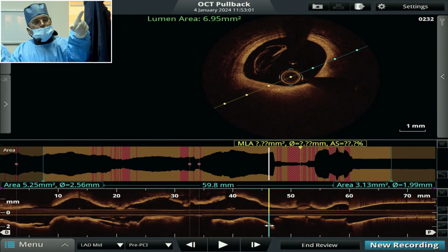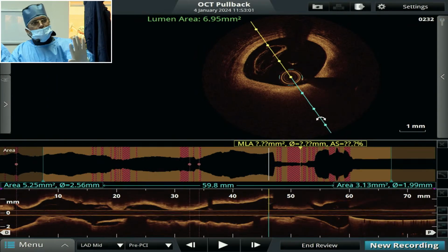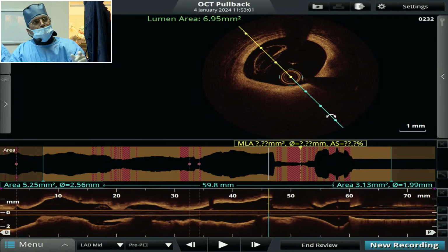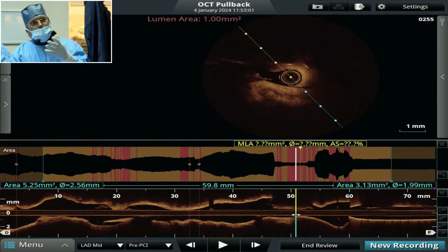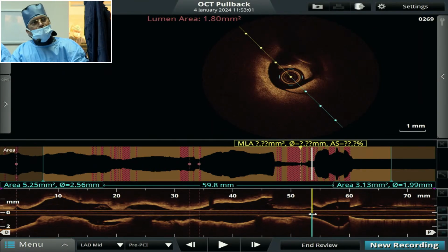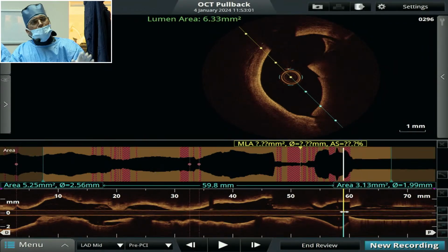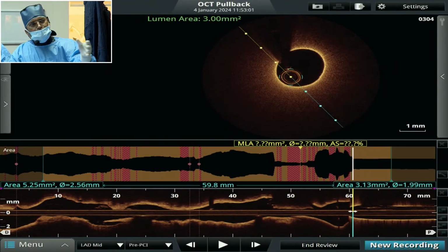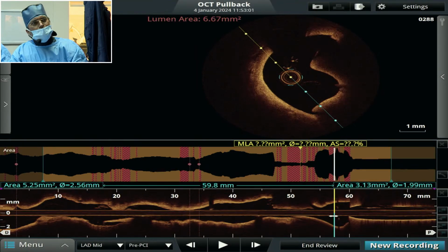Just rotate that upper one. Then move forward, move toward the left main. There are artifacts, no need to pay attention. These are all artifacts. We land at the 40 level, then move toward this side, move.